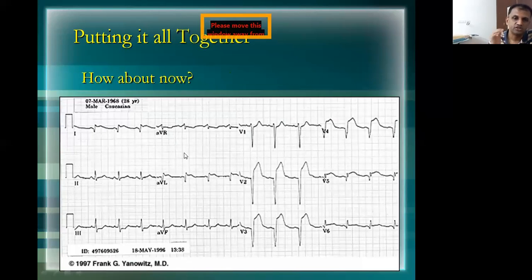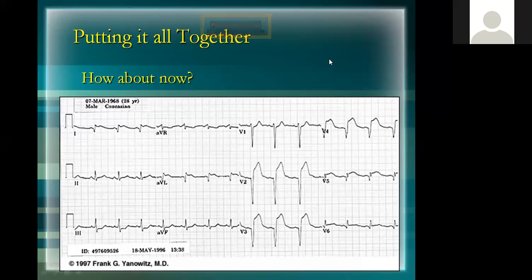Is it a normal ECG or abnormal ECG? Come on, guys, you are all intelligent. ST elevation. Good, excellent. Which leads? V2, V3. Excellent. V4. Good. One important thing. AVL. Yeah, good.